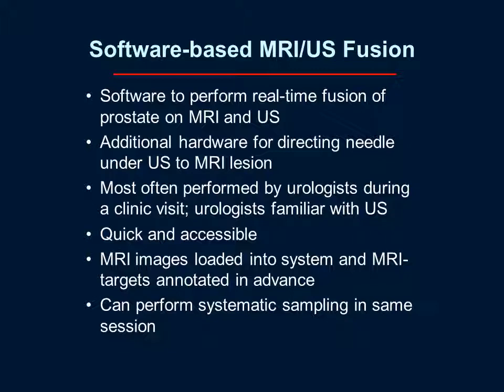So I'm going to comment in a little more detail about the software-based MRI ultrasound fusion approach, which is gaining rapidly in interest and adoption by urologists, and it's what we use in our center. Again, this uses software for real-time fusion of the modalities. There's additional hardware for directing the needle under ultrasound to the MRI-defined lesion. This is often performed by urologists during a clinic visit. It's easy for urologists to integrate into their practice. They're familiar with ultrasound. It's quick and accessible to them within routine workflow.